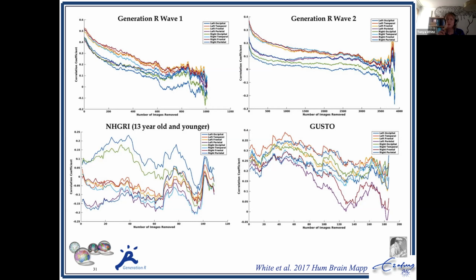No. Well, for these images here, this is 1070, or it might have been actually a little less, because the really bad images couldn't be reconstructed via FreeSurfer. I would actually have to look up the exact number, but we ran them on all FreeSurfer data that could be reconstructed. So quality assessment occurred, but you don't see that in this image, because this was more about looking at, if you can reconstruct it, what's the relationship?